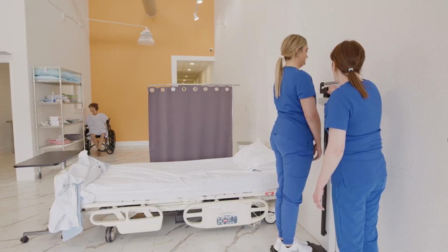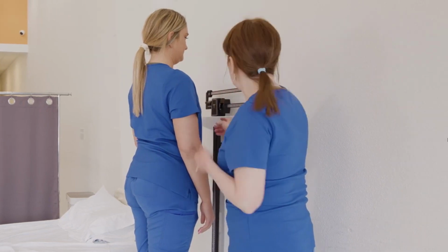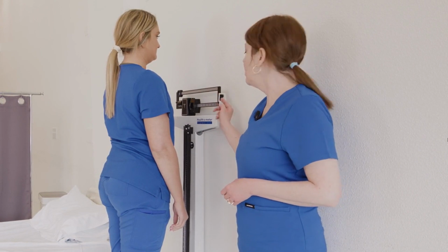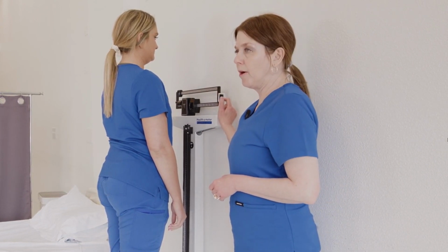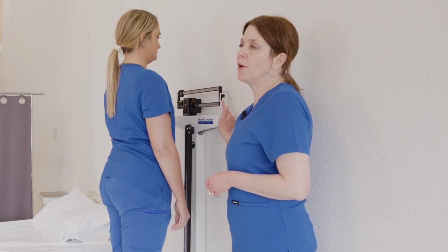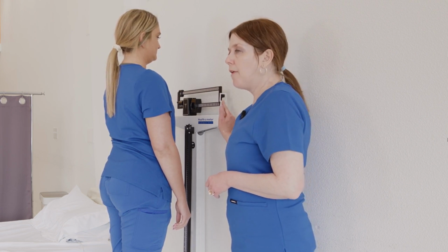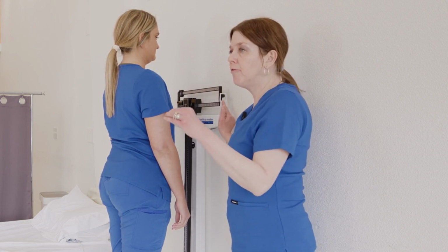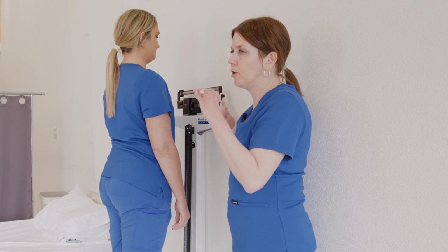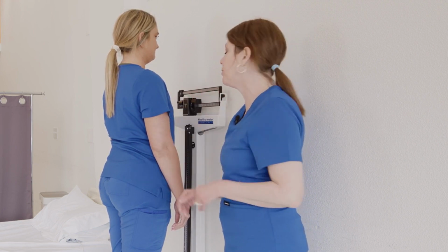Now the large block at the bottom will be moved by 50-pound increments until we see our arrow in the center line on the bottom of the square. When the arrow falls to the bottom of the square, you have gone over by 50 pounds. At that point, you back it up 50 pounds, and then you're in the right set of 50s for your patient.